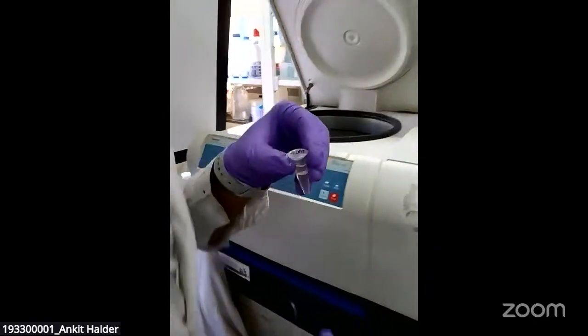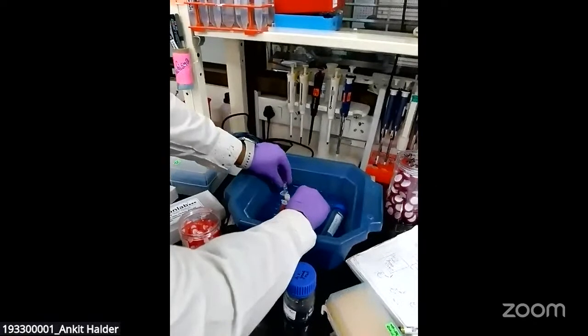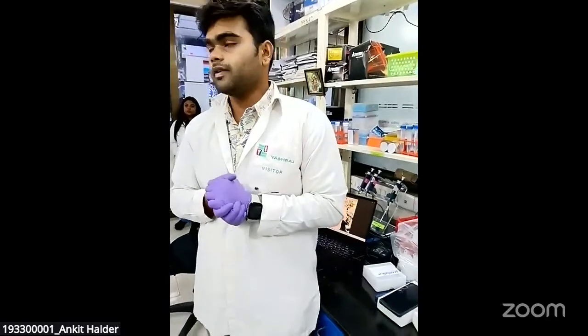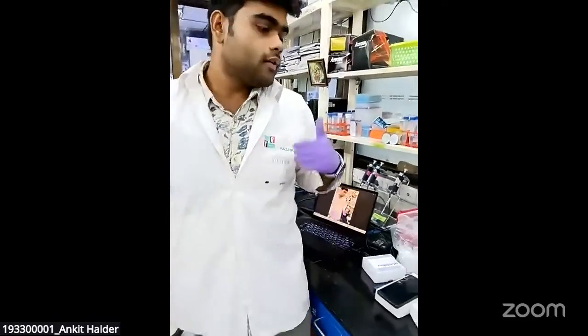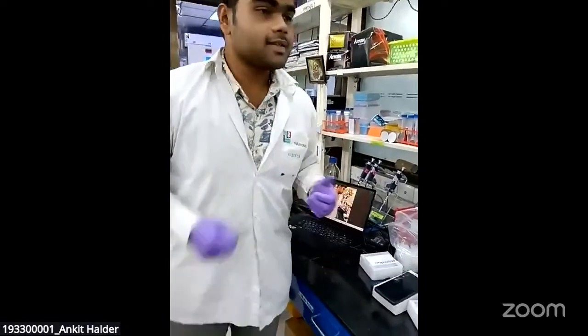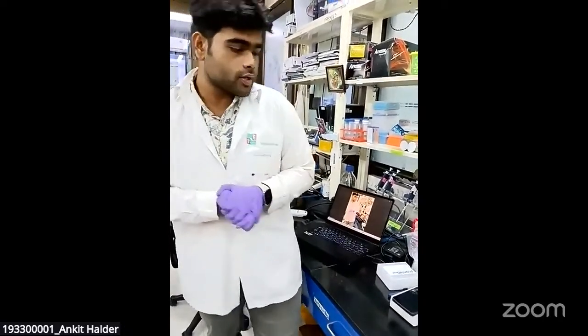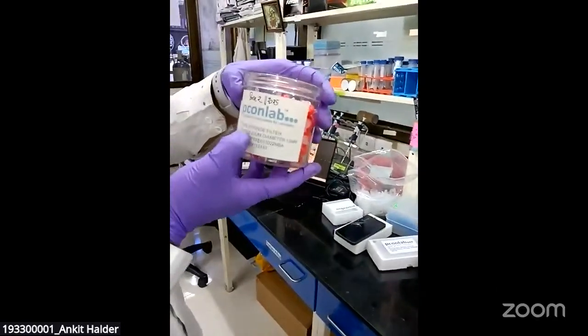So after getting the metabolites and the lipids from the samples, it is not just over. Once we have dried the samples, you can store them at minus 80. Suppose you are now going to run it in the mass spec, you can store it for a while. But whenever you are going to use the mass spec, as I said, we need to reconstitute all the samples, whether it's for lipidomics or for metabolomics. After reconstitution, you need to filter the sample. For filtration, this is the PTFE filter.